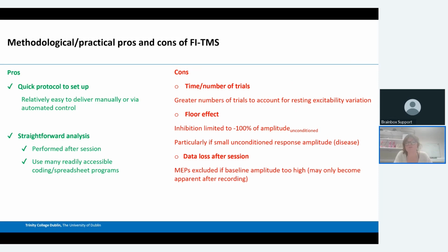But what people will often do is just kind of try to monitor the person's relaxation during the session and then bin the few trials where they couldn't relax afterwards. But what you will see in papers is people saying the person just couldn't relax, and or we didn't account for it during the session, and then we had to disregard their data because there wasn't enough clean data afterwards.